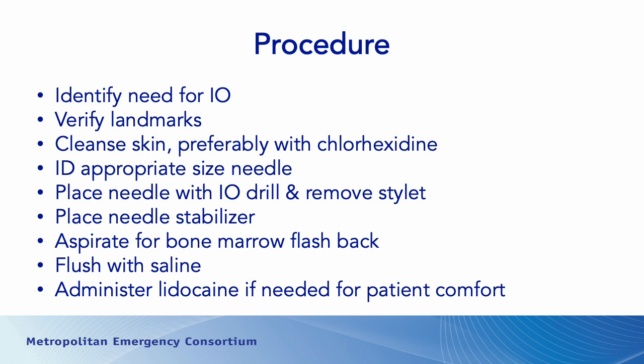You need to see either bone marrow or fluid to verify placement. If you put it in, you aspirate, and you get nothing back, even with a good amount of aspirate pressure, you shouldn't use the device. Same thing if you try to flush it with saline and you get no flow. If you get no flow with the saline, you just can't push hard enough to get it to flow through. Stop the procedure, take the device out. And then administer lidocaine if you need it for patient comfort.